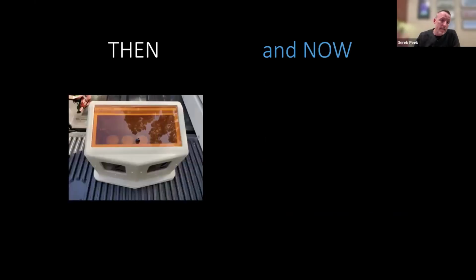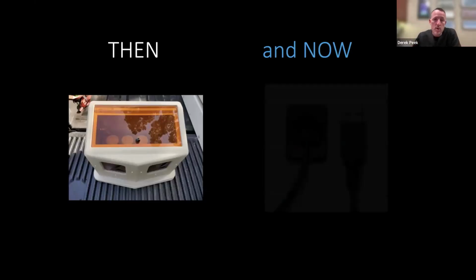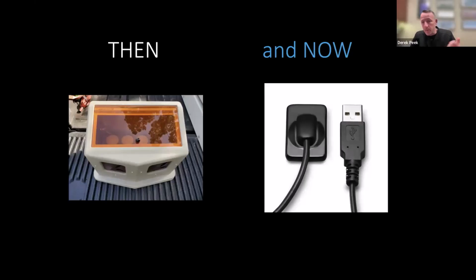Also, I did get to experience this. This is a quick fix dip tank for those of us that had to take films during dental school and wanted to know whether we got our working length right. We could put it in there and dip it real quick in about a minute and see if we got the right working length. For those of you that have no idea what this is, good for you. You just had digital, and we can press a button as many times as we want until we get what we want.